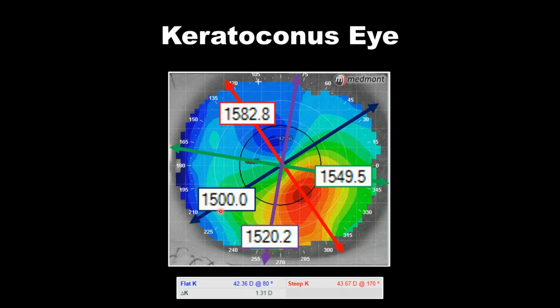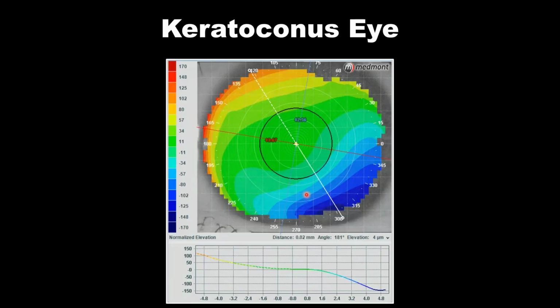So what you understand about the irregular cornea is what makes it such a challenge is not the droopy apex. That might factor in there, surely. It's not how steep the cornea is. It's that the eye is so asymmetric that we need to apply a lens that has that similar asymmetry. And we shouldn't expect a symmetric corneal GP to be able to manage this very asymmetric surface.